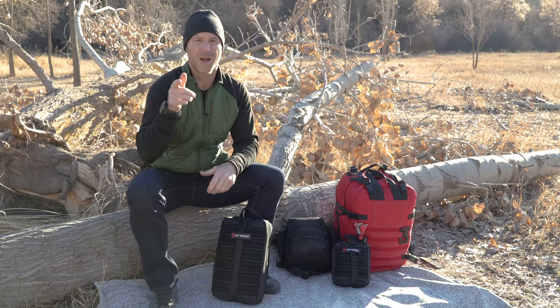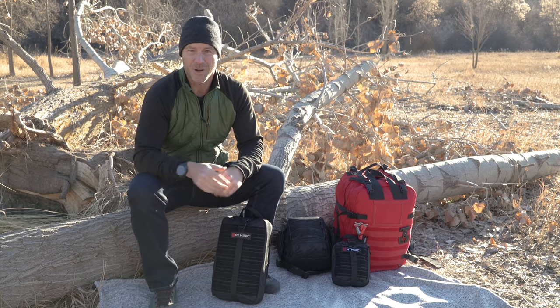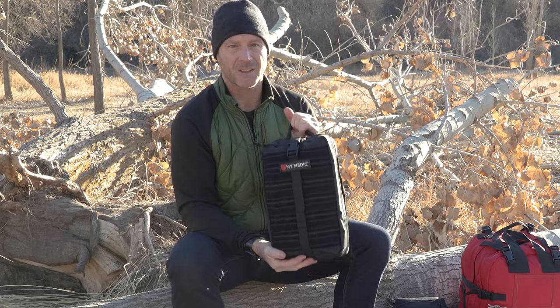Hey, what's up guys? Billy Haley here at MyMedic, Director of Education and Product Development. I'm super stoked to show you guys our newest kit, the MyFak Large.